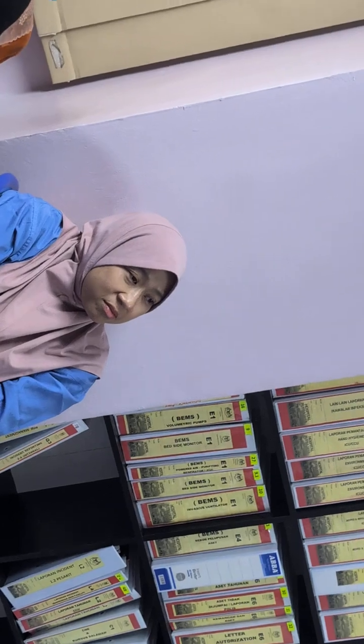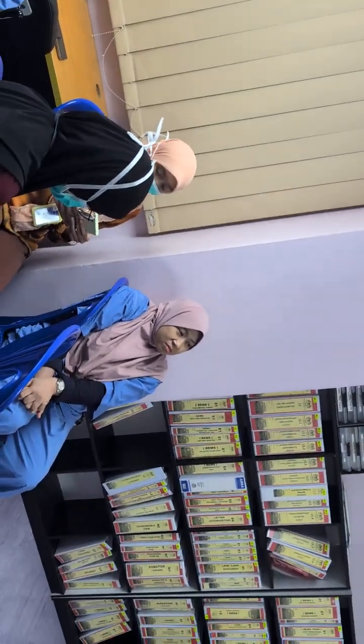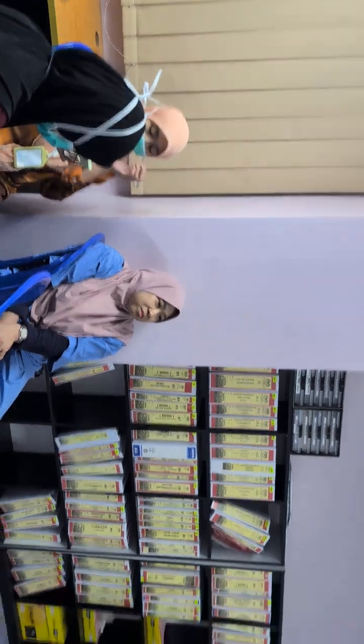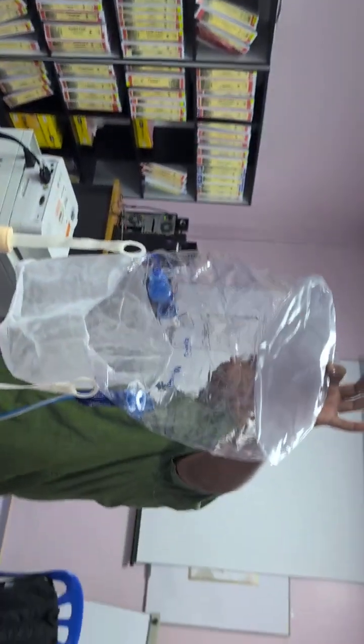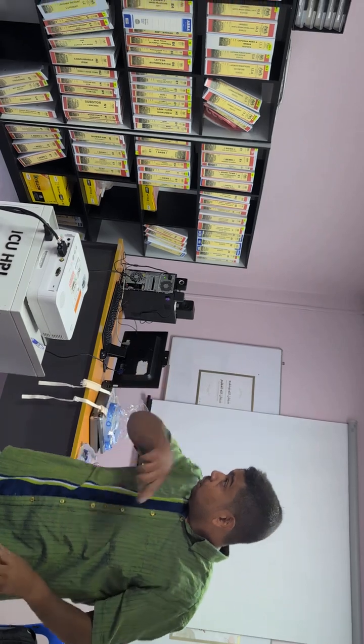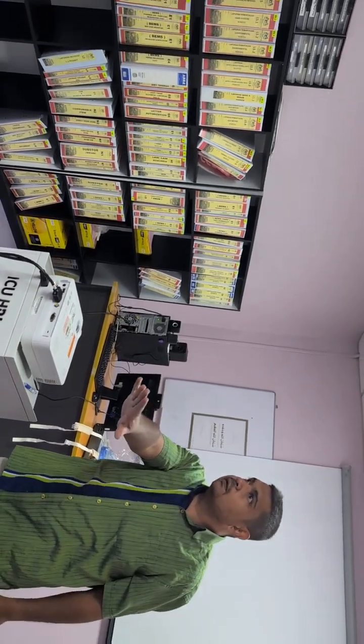Okay. But doctor, for your emergency setup too, I'm not sure whether this mask is that mask. This is not suitable for ICU. Absolutely not. Okay? But if you're going to wean off, you're going to send the patient to the ward, yes. It fits that.